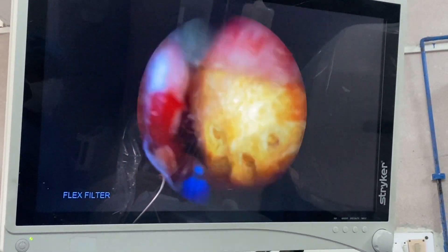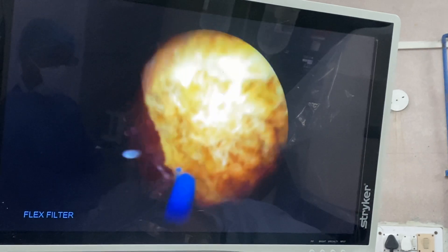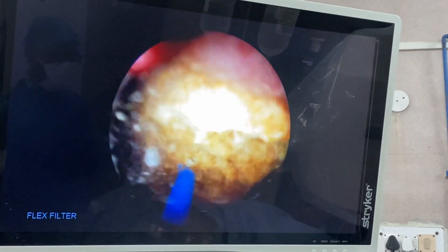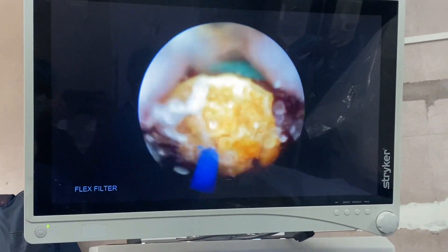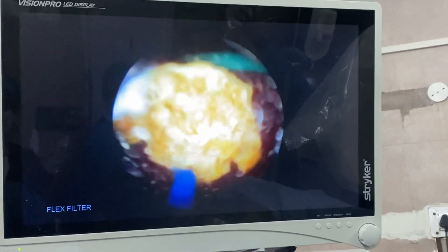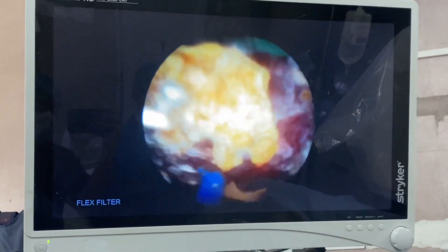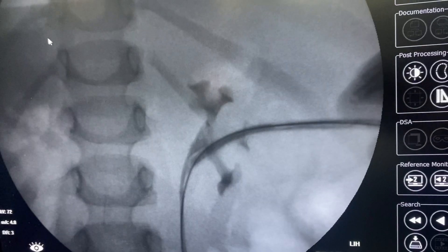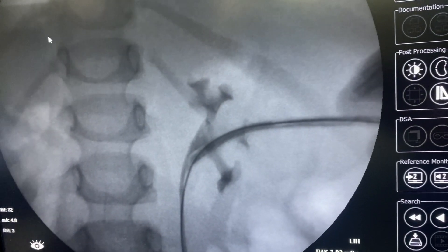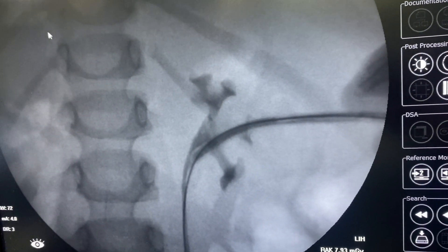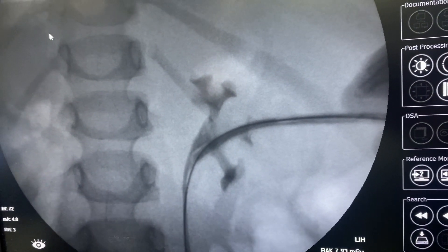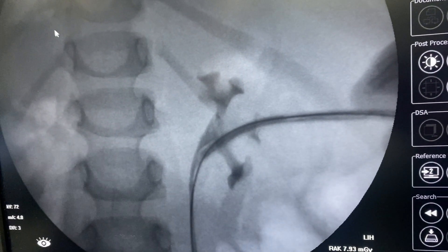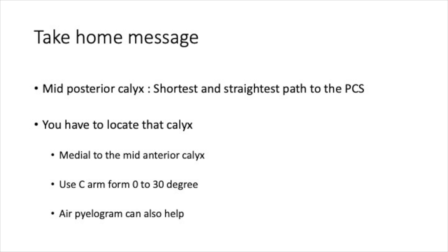After this the procedure is straightforward. Using the holmium laser, the stone was completely ablated. This is the final picture after removal of the stone.